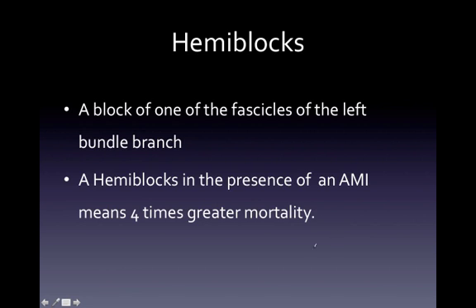Okay, so one more to talk about here, and then we're going to talk about them again so we can really drill this home. This would be negative numbering. So to leads 1, 2, and 3, 0, 60, and 120, these are all positive electrodes. So if it was headed in this direction, from all of their perspectives, the point of origin would probably be somewhere in the ventricles.